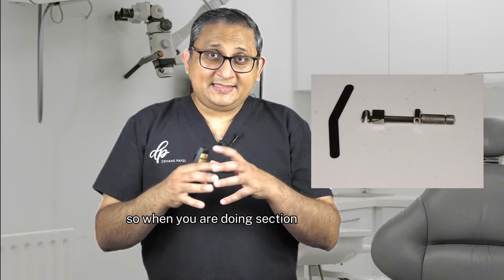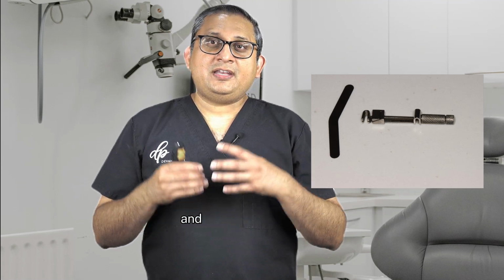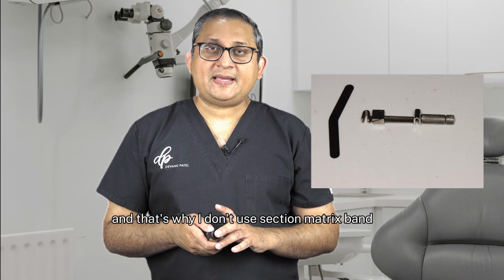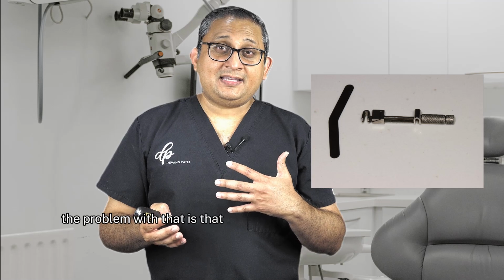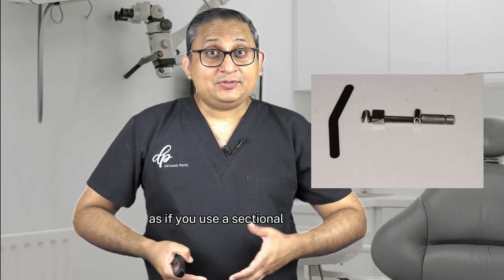So when you are doing a sectional matrix band, it's very difficult, because the tooth is quite badly broken down, and that's where it's very tricky to use that matrix band, and that's why I don't use a sectional matrix band for DME. And the problem with the Tofflemire is that the contour is not going to be as great as if you used a sectional matrix band.